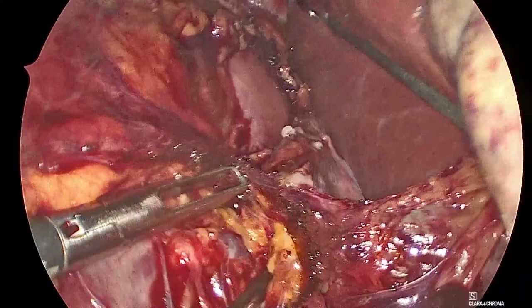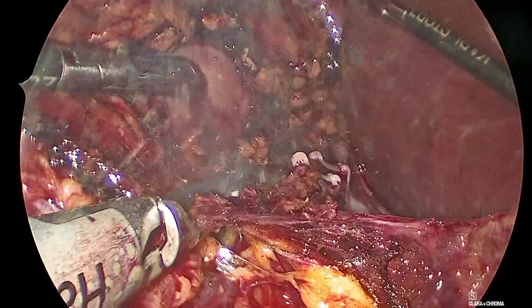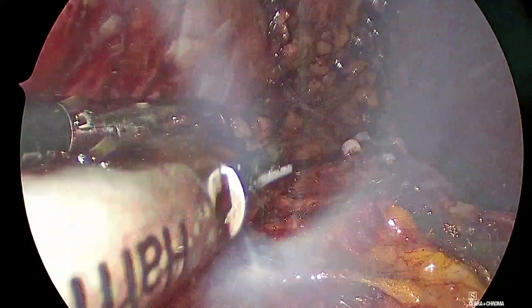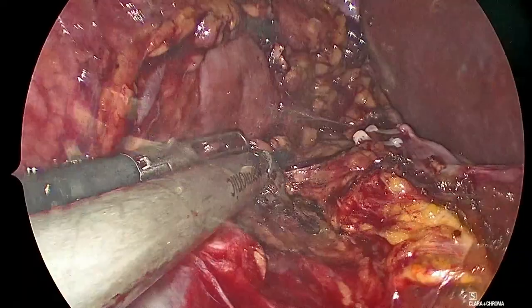I think this is such a nice, honest statement, Alberto. We do exactly the same, and the bladder cuff needs to be complete for the ureteral orifice, and I also think it's the safest way. Good. So we agree in something. Maybe not the first time. Yeah.